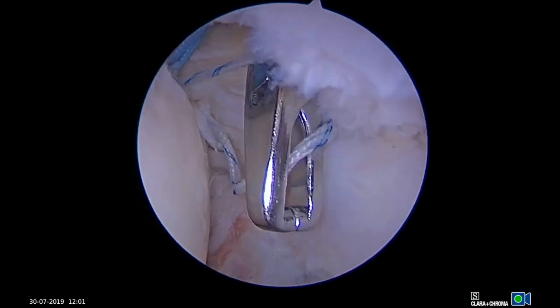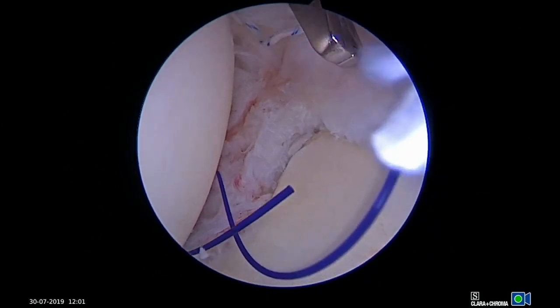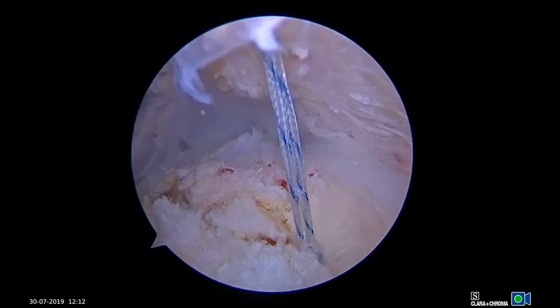A suture retriever is used through the subacromial space to retrieve the anchor and passing suture, and the suture is then shuttled through the rotator cuff. This process is repeated until all sutures are passed.